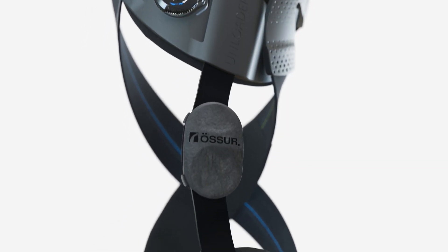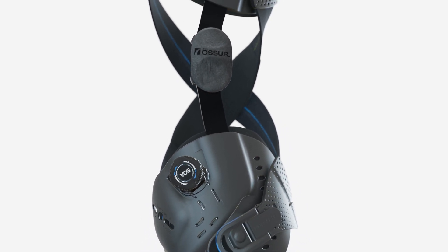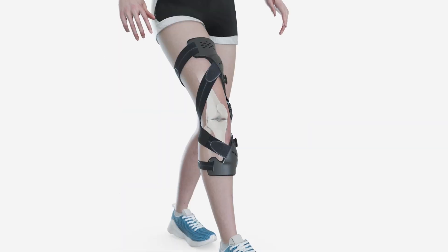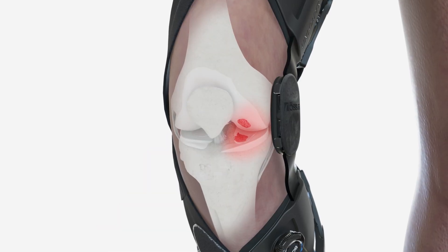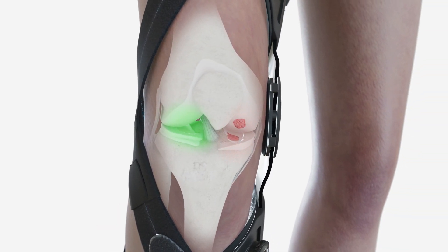The Unloader 1X is a biomechanical intervention for unicompartmental knee OA and other conditions requiring unicompartmental load reduction. By applying a patented three-point leverage system using dynamic force straps, the Unloader 1X utilizes the areas less affected by the OA to reduce the pain.